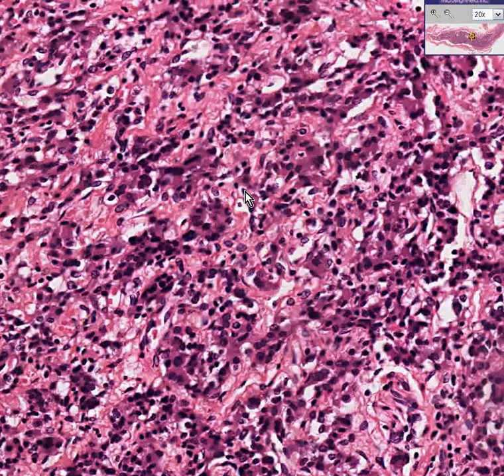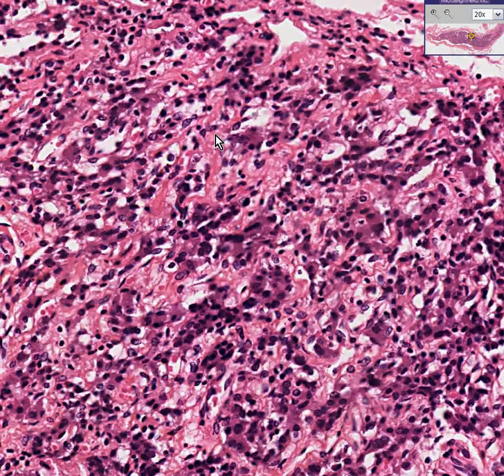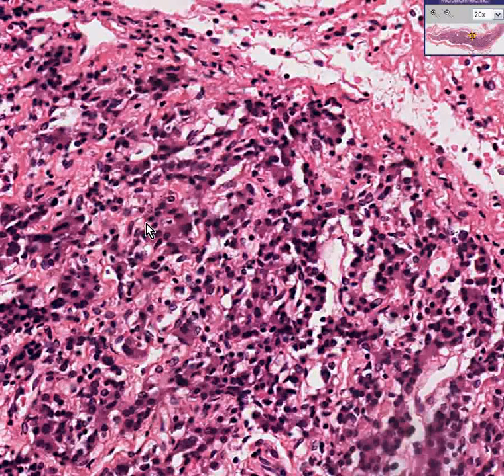In addition, there is a really tremendous amount of infiltration around these primitive glandular structures of chronic inflammatory cells, lymphocytes. It's almost as though the body was attacking its own adrenal cortex. In fact, it's more than almost, it's exactly what happens. This disease is called primary chronic adrenal insufficiency. For all practical purposes, Addison's disease, just like the one that JFK had.